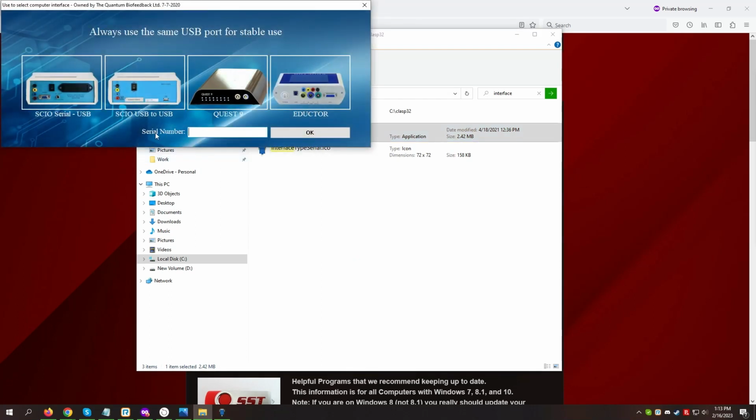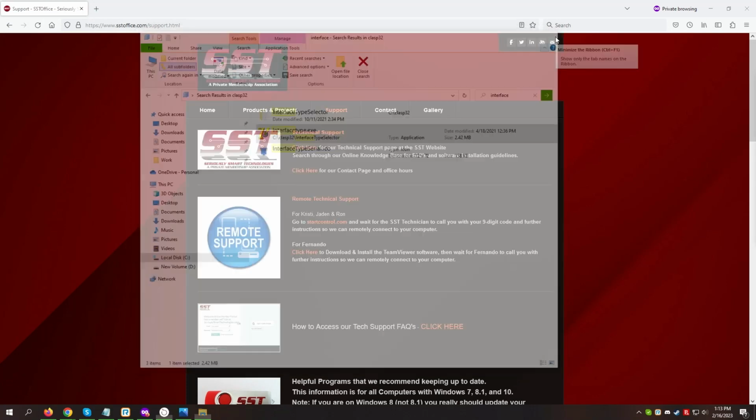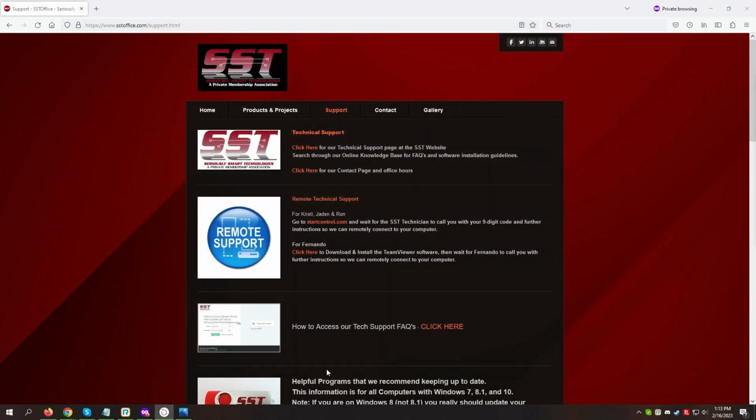Now, once this panel is open, you're going to select your device that you have connected. In this case, it's a SCIO USB to USB, and then you're going to enter in your serial number. This is a SCIO example serial number, but you'll want to enter in the one on the back of your device and then hit OK. And that will close, and your device should be all set, and you should find it recognized the next time you open your software. If you do not, do not hesitate to reach out to us for more assistance.